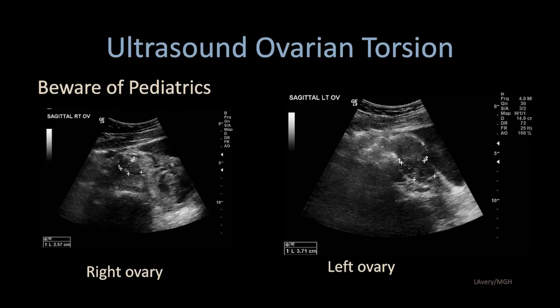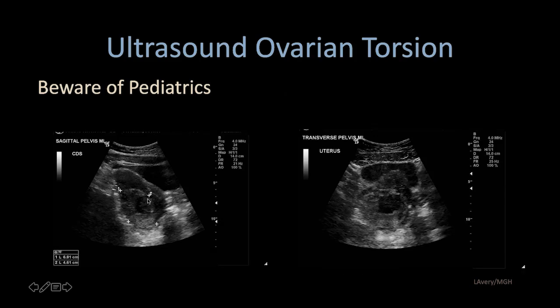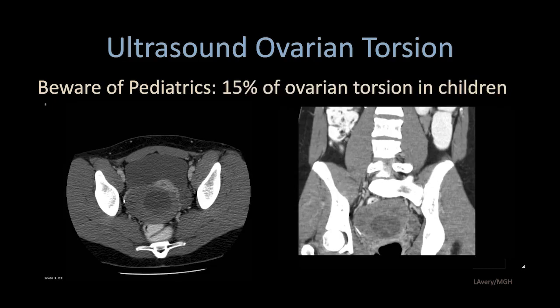Beware of pediatrics — this is a difficult diagnosis frequently because of the inability to perform transvaginal imaging. Here we have transabdominal imaging with the right and left ovaries marked. However, in the midline we see a large heterogeneous echogenic structure with mixed echogenicity, near the fundus and lower uterine segment — very difficult to characterize. But at CT, it's easy to identify this as a large torsed ovary down posterior into the cul-de-sac, with the measured structure likely representing the twisted vascular pedicle.